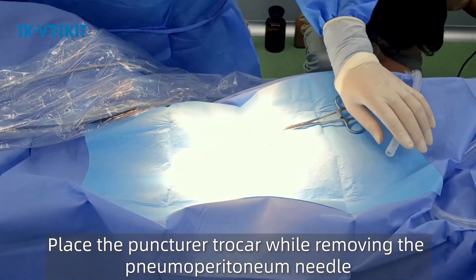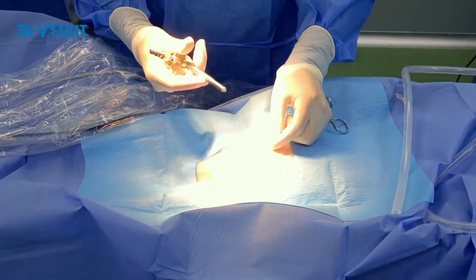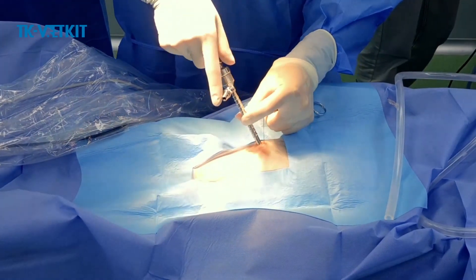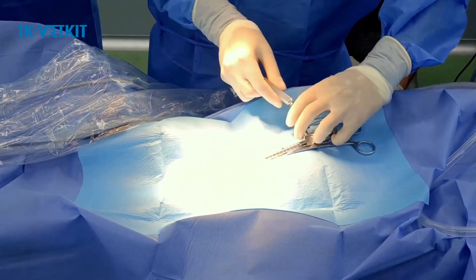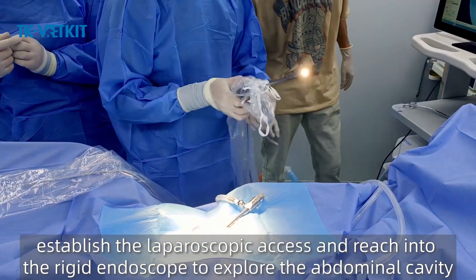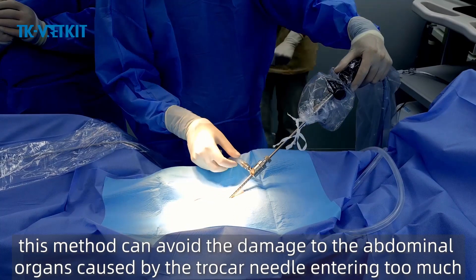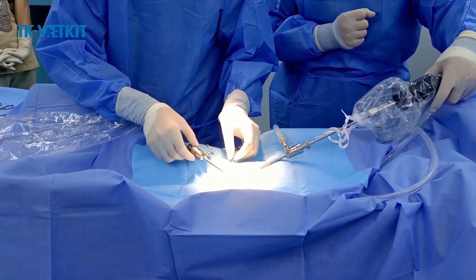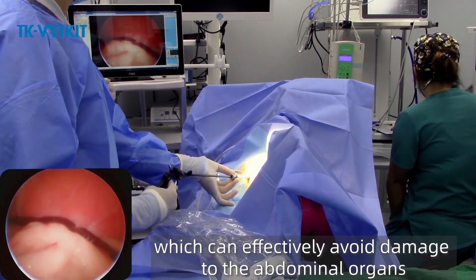Place the puncture trocar while removing the pneumoperitoneum needle and attach the pneumoperitoneum tube to the trocar. Establish the laparoscopic axis and reach in with the rigid endoscope to explore the abdominal cavity. This hand-holding method for the trocar can avoid damage to abdominal organs caused by the trocar entering too deeply. Guided by the laparoscope, instrument access is established at the appropriate location, effectively avoiding damage to abdominal organs.